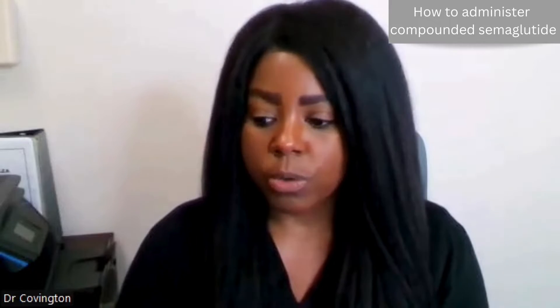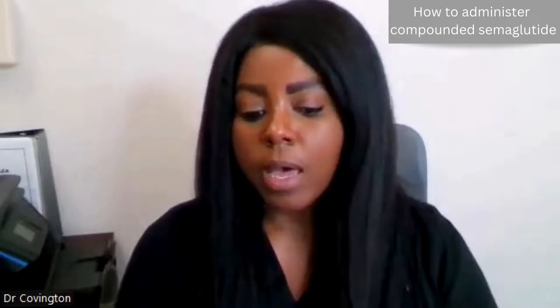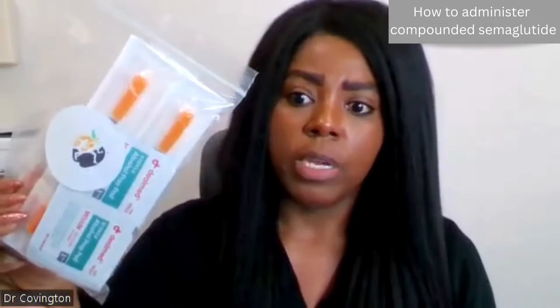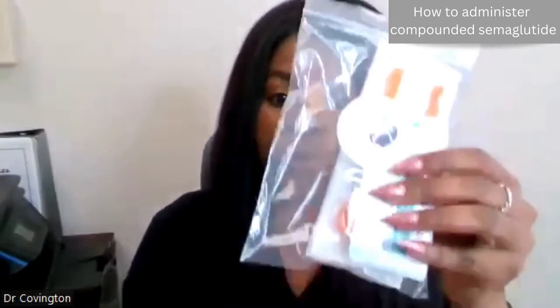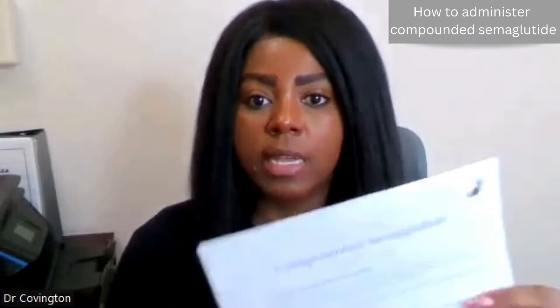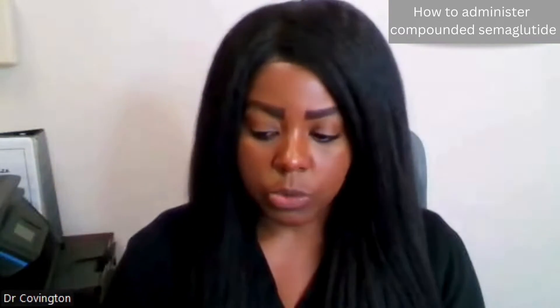I cannot record my tabletop, so I am going to pull things up so that you can see it in the camera view. In your packet — and this may look different over time — but at least for right now, what you're going to have is, of course, the vial or the medication. You're going to have alcohol wipes and also the syringes and a set of instructions to walk you through the process as well.